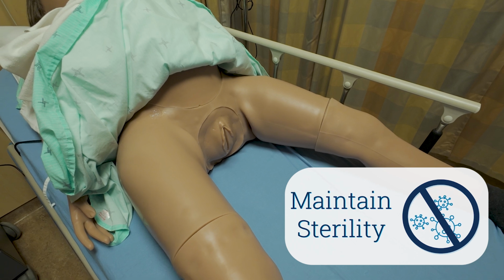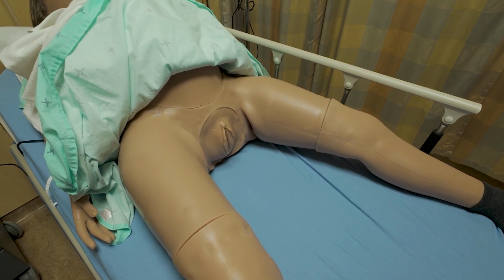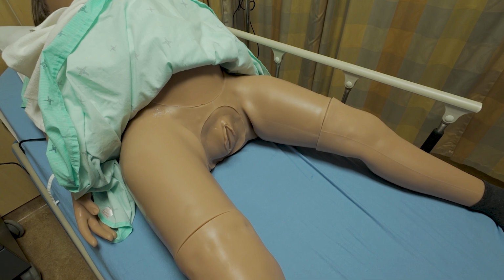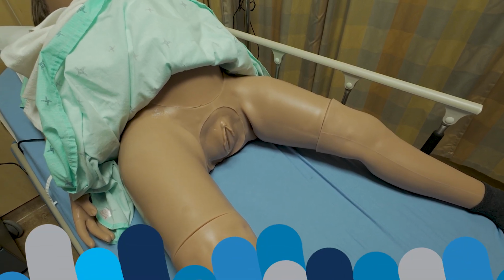I'm going to have an assistant hand me my amni hook once I'm sterile, and I'm going to talk to my client through this entire procedure because it is an invasive procedure. It's important that your client is aware of that.